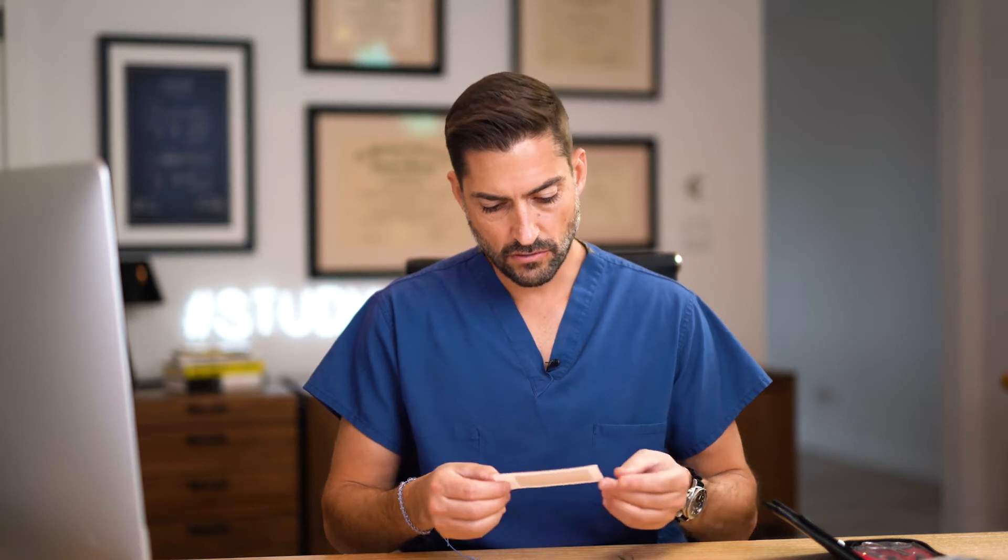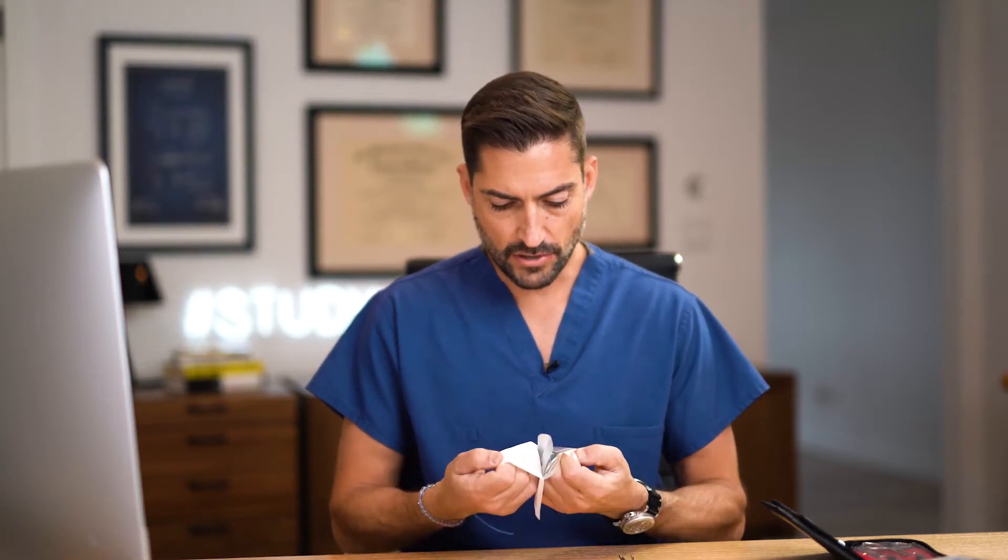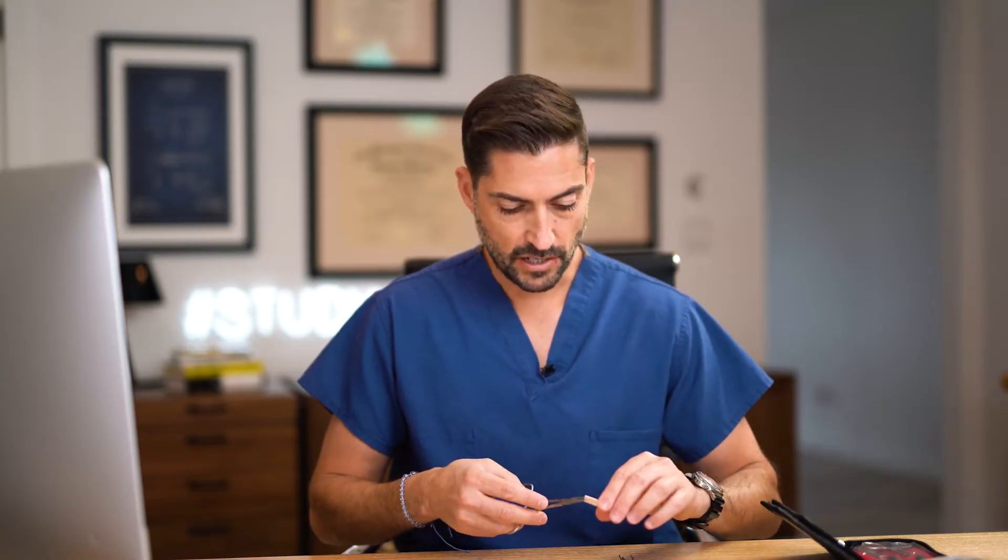I'm going to grab my forceps, my Adson forceps, and my needle driver out of that, and then I'm going to get some suture. I'm going to grab some 3-0 nylon. This is a monofilament — we'll talk about what kinds of sutures there are, the materials, and why you use what in a different video. But this one, we're going to tie some knots.